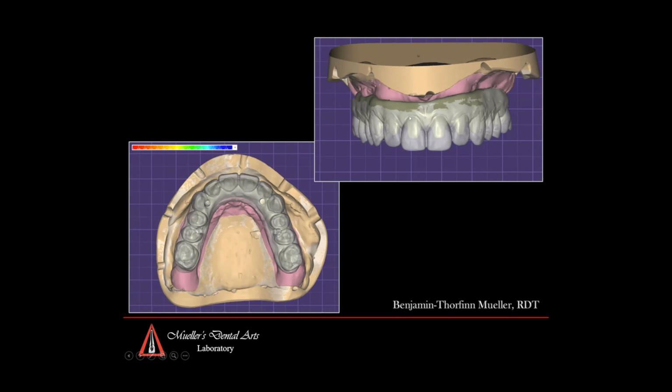Do not place the margin of your prep design at the gingival margin of your diagnostic setup. Since we wrap the frames in pink composite down the road, you want to be able to cover the 1 to 2 millimeters of the gingival margin in composite so that you get a true seal. You can do it if you leave it where the gingival margin is on the diagnostic setup, but then your entire clinical crown becomes even shorter.